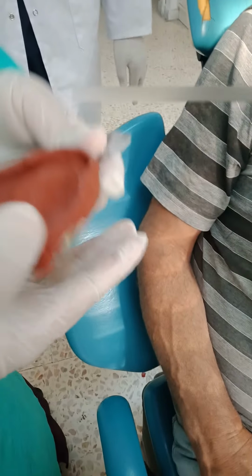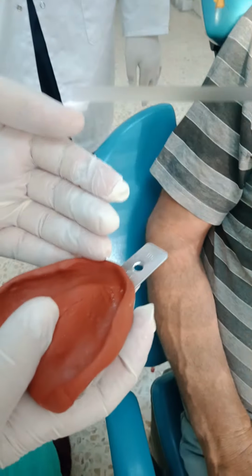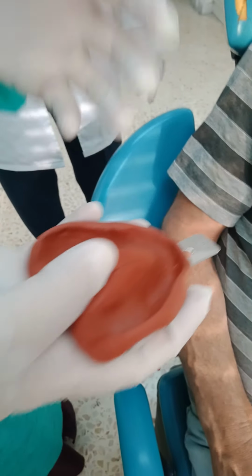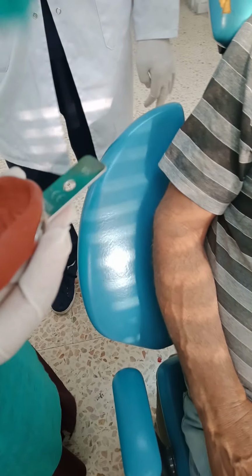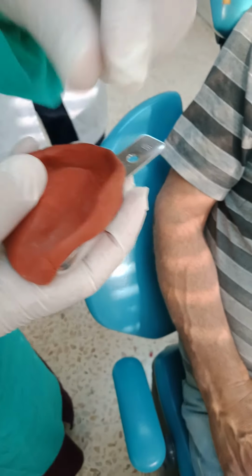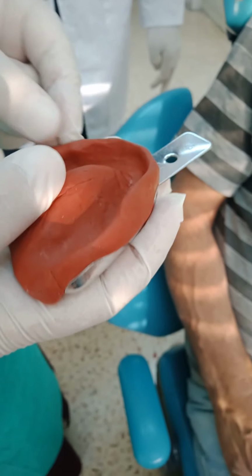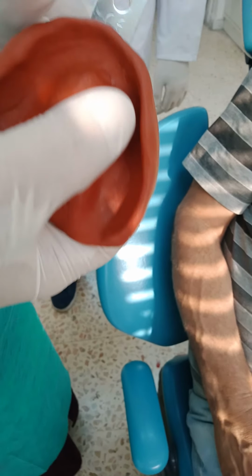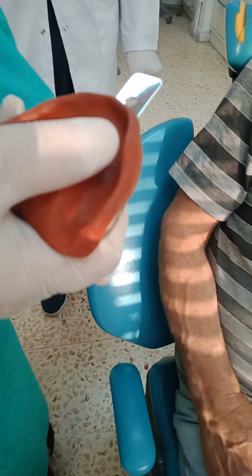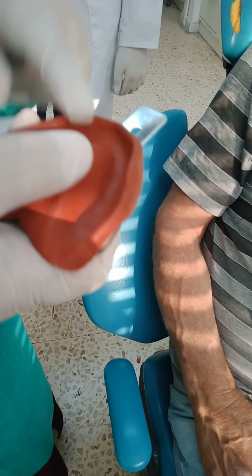Now, how to repair it? You have 2 ways. Either heat it all together and put it once more in the correct position. Another way, if you want to be quick, take a quarter of a cake, melt it until it's soft, and add it as border molding. With your finger, when you take it inside, the hard impression will act as a tray. The new material is soft, so it will support it and push itself into the sulcus, and by your finger you adapt it into the sulcus. Then do the border movements and make sure you record the labial correctly.